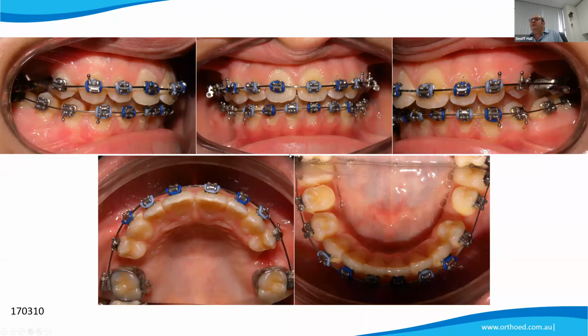So when I was using that power chain, I actually had a transpalatal bar in place. Yeah. So isn't that going to pull the 6 forward as well? Yeah, but once again, the transpalatal bar was there, and I was just checking on the anchorage requirements, because if I felt that I was losing anchorage, I would have stopped the power chain and just started running more class 2 elastics. The transpalatal bar will stop it rotating on the palatal root, won't it?